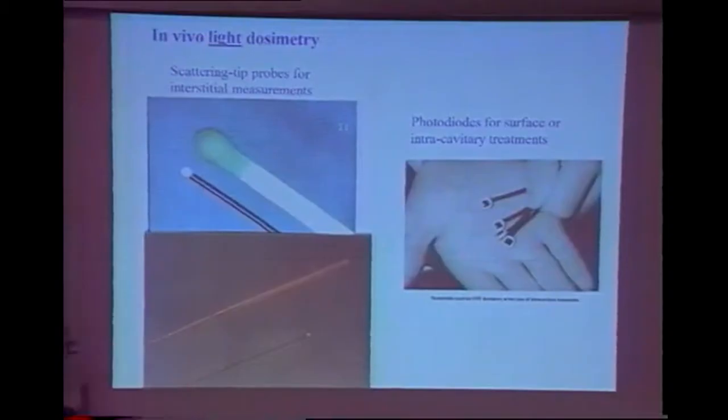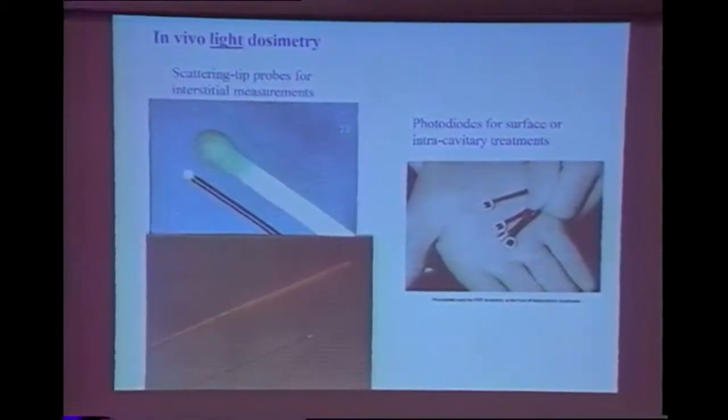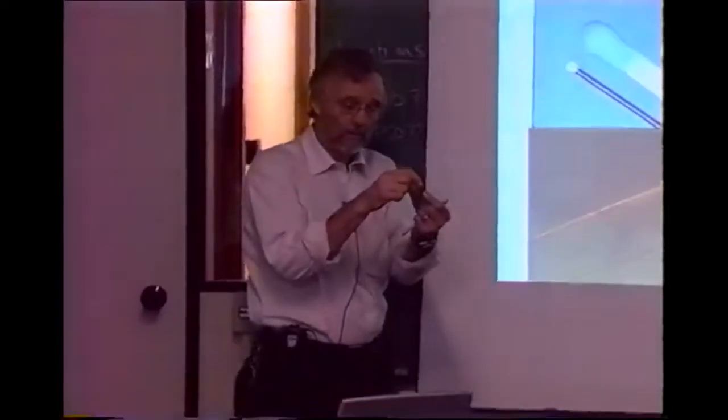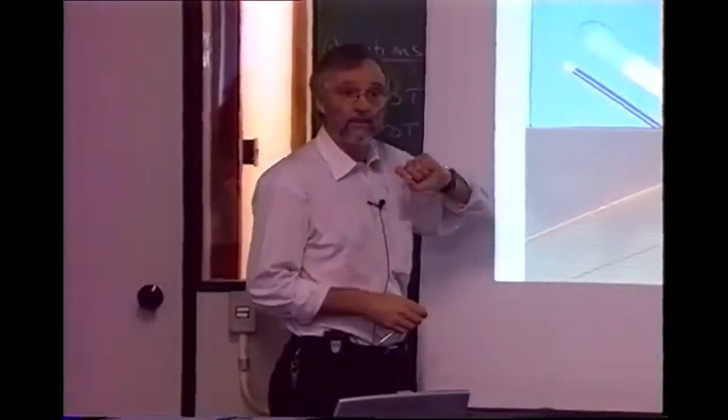How is the surface made? Is it a light surface? Yeah, people have done different things. You can do it by taking a little sphere of epoxy mixed with some titanium dioxide, and then you just make a little tip on the end.